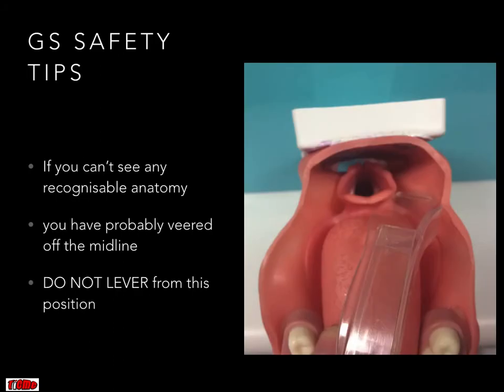Now, here are some important safety tips I want to tell you about the Glidescope. There are some reports in the literature of damage to the pharynx from the Glidescope technique, and I think I know why after one or two episodes.